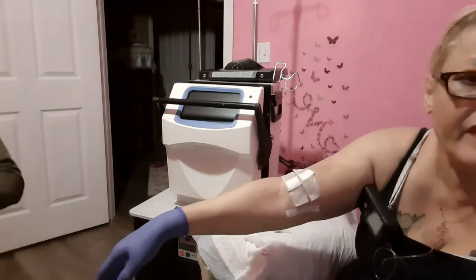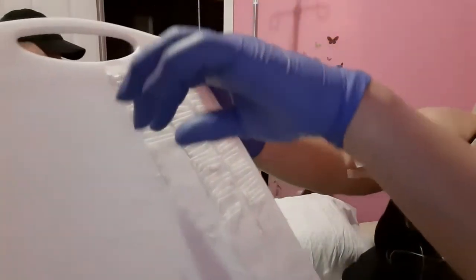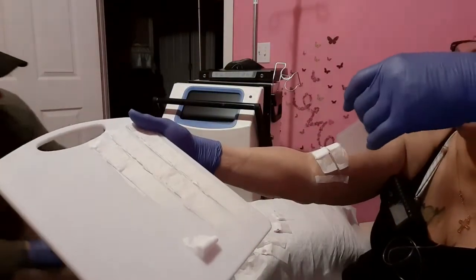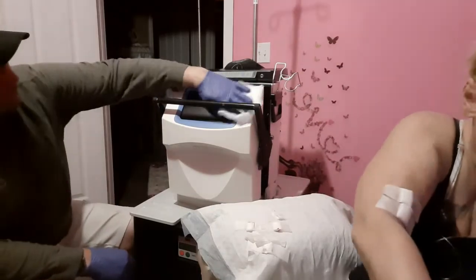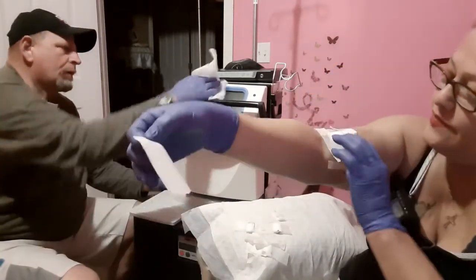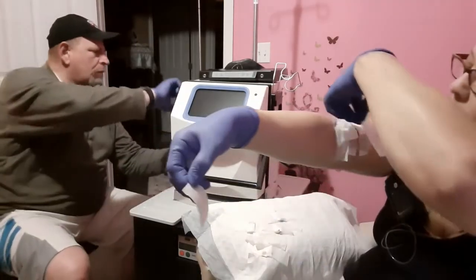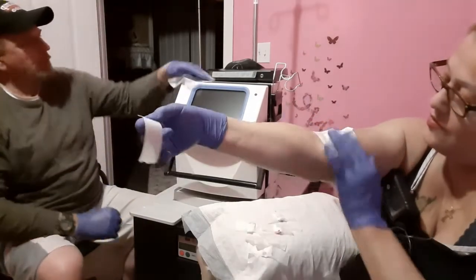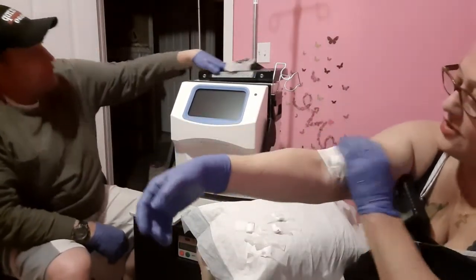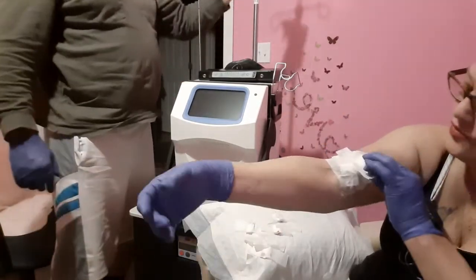And then we're going to take my tapes here that I've lined up right here together. And we're going to take four of them. One, two, three, four. And just pull it right off the board. I think I only got three, but that should be good anyway. All right. So there's three tapes on here. And pull one at a time. I may need one more. Okay. There's another one. And the last one. All right, that's good enough. I think maybe one more. Right there. Put some pressure on there.